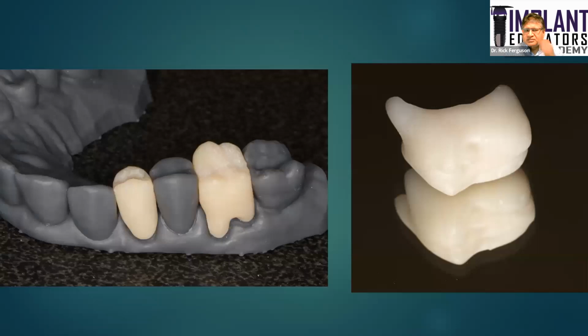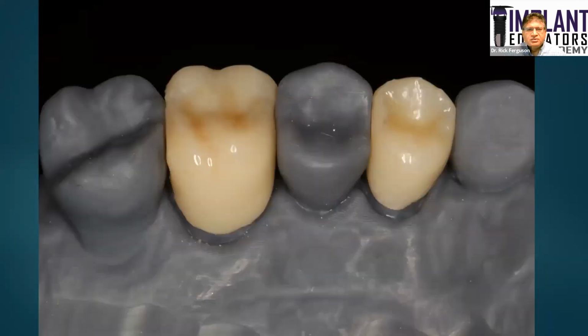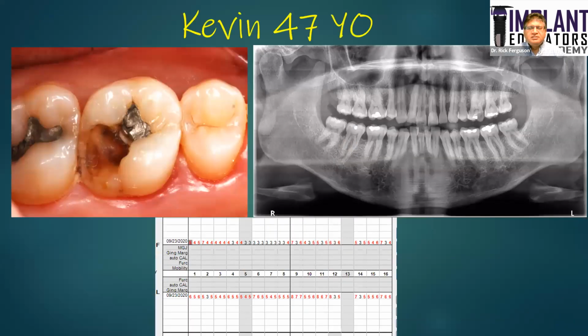But this resin is actually one of the first ceramic filled microfilled resins that was on the market. And it had a lot of promise for us because we could characterize it and make it look very similar to the kind of crown you could get with milled crowns with emax and so on. And of course, at a very low cost. So this is one of the cases where I used it.